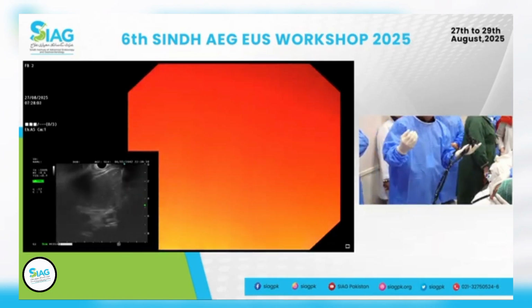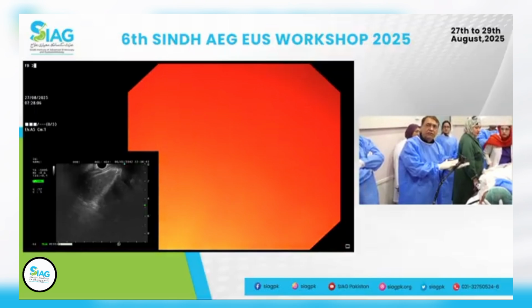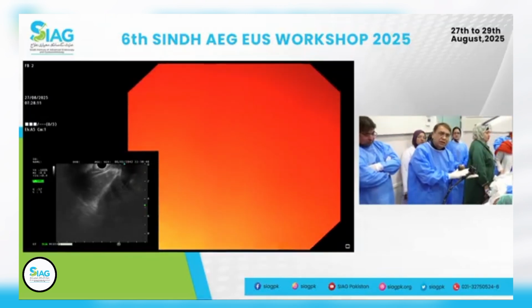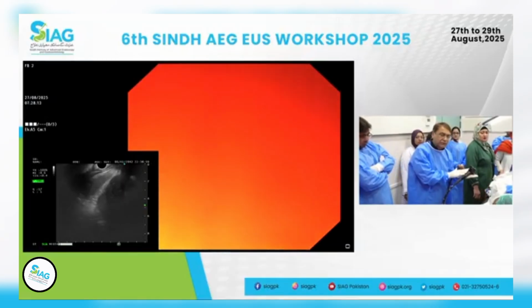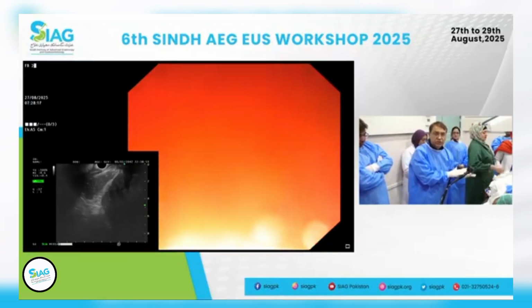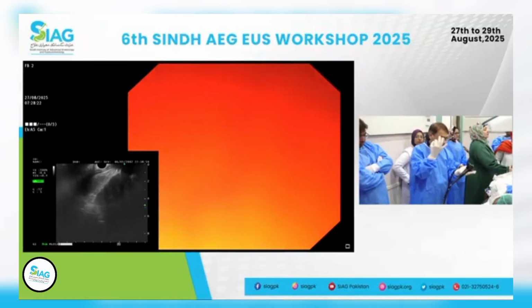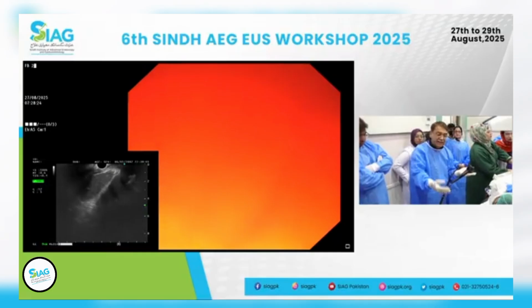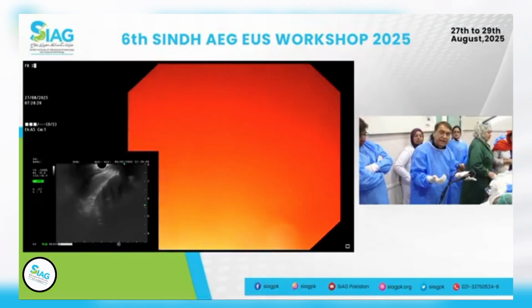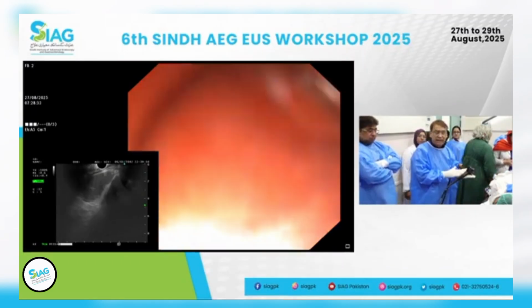And usually what I'm trying to stress is the left hand is the one which is going to hold the scope, control the scope, do all the rotation basically of your scope. So utilize that as much as you need to for this type of movement of the scope. Right hand is for accessories. Right hand is just to advance the scope or pull the scope and give you a little bit of assistance. Most of the movements are going to happen with the left hand.